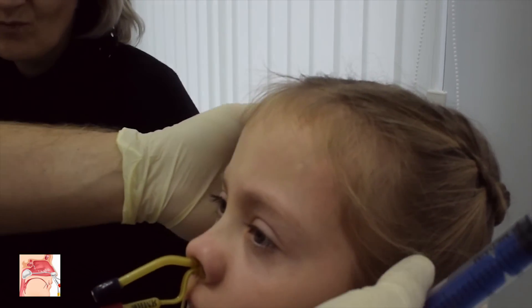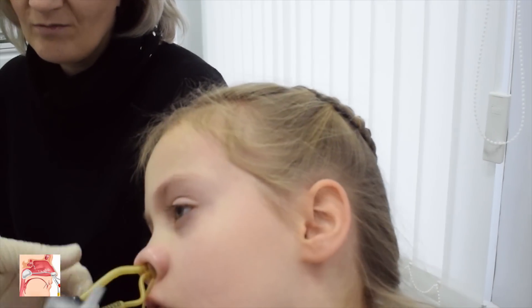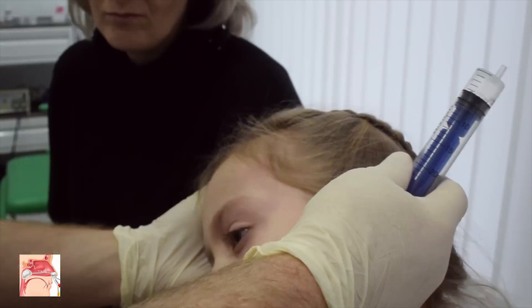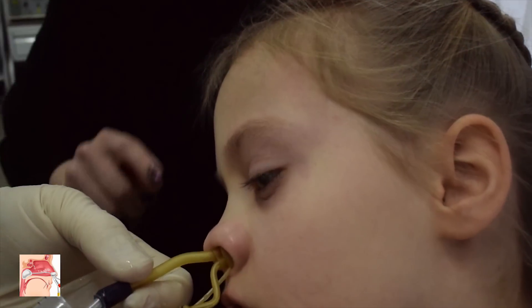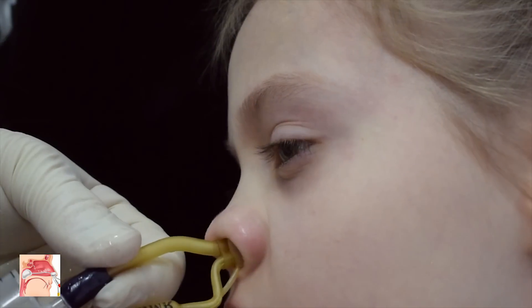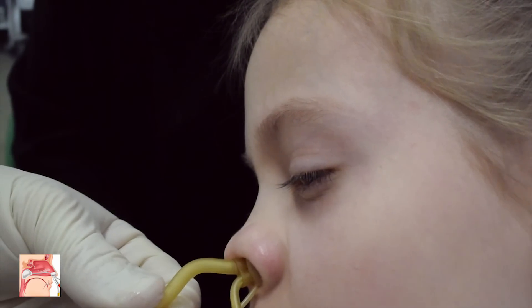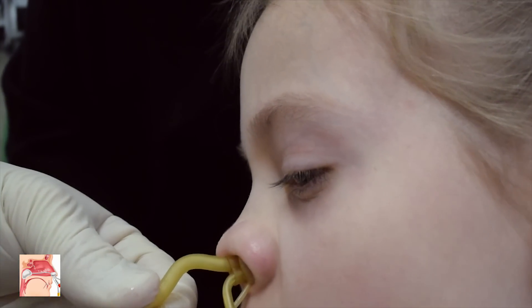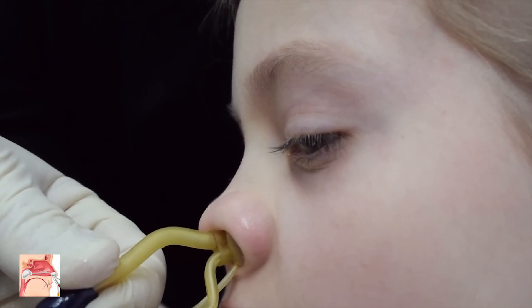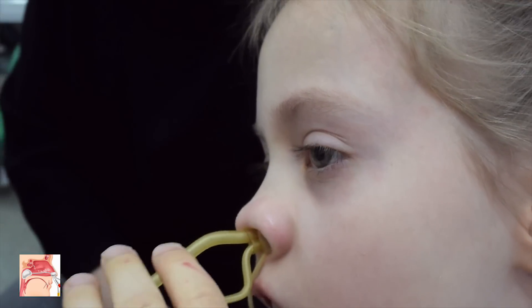Sealing is mandatory for the YAMIC procedure. In order to provide good visibility of nose wing movement for the physician, the patient's head should be tilted during seal check. When the syringe plunger is pulled, the nose wing should be drawn in and returned to the initial position, synchronous to the plunger movement.